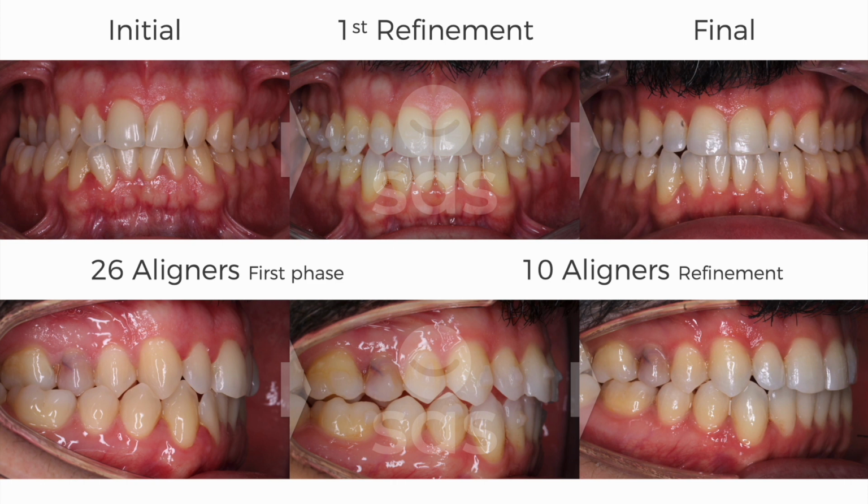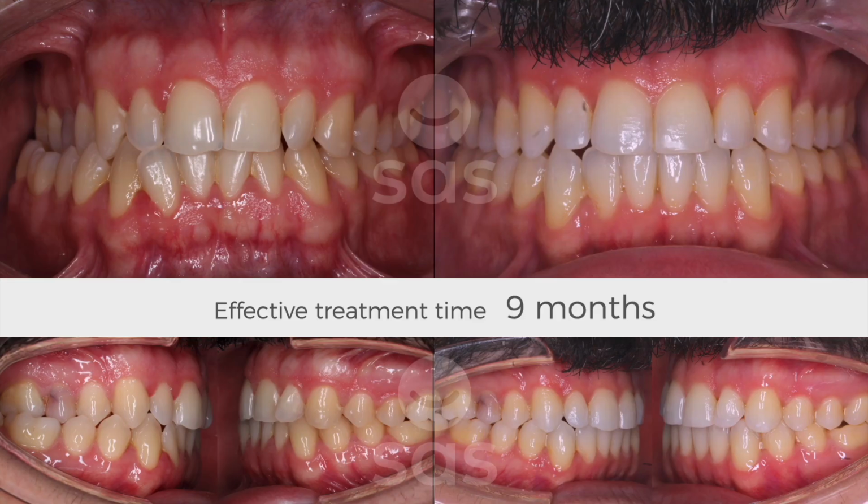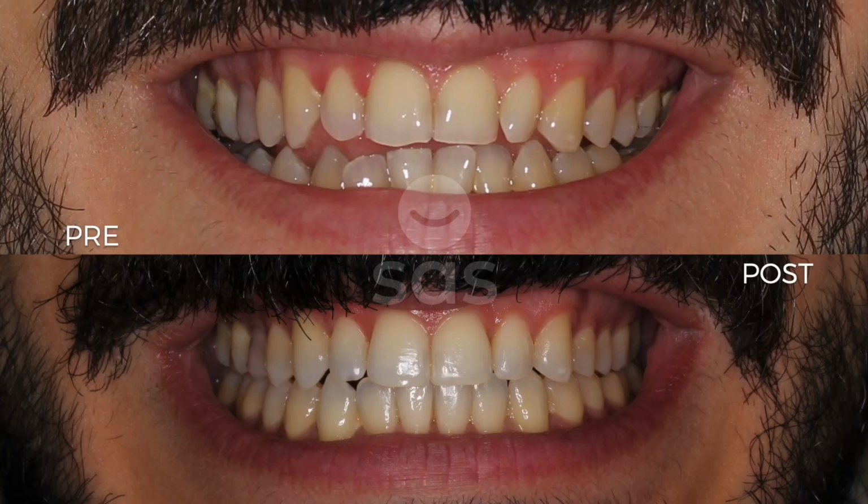After finishing the first phase with 26 aligners, we have corrected the functional deviation of the patient and the crossbite. The patient was positively surprised at how his bite had improved, and most importantly for him, how quickly it had changed. With 36 aligners in 9 months, the treatment is finished. We also made the occlusal adjustments to get a balanced functional occlusion, as in the previous case. This type of adjustment, together with night retainers, is very useful to enhance the stability of the treatment.